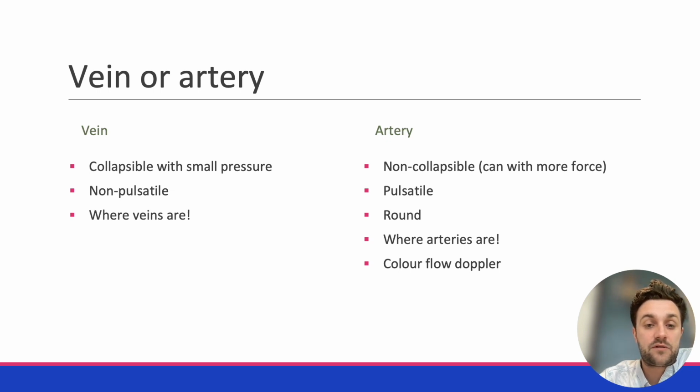It's important to note that whenever you're putting the probe on, you put the probe on with as little pressure as possible. Often whenever beginners are doing this, they say that they can't see any veins, but it's because they put too much pressure on the probe, and whenever they lift it up a wee bit, the veins will then become visible.